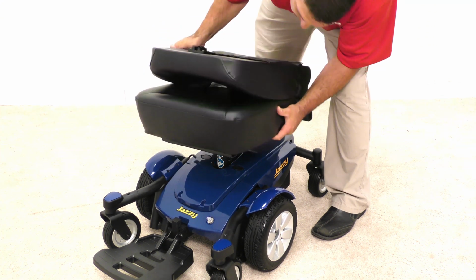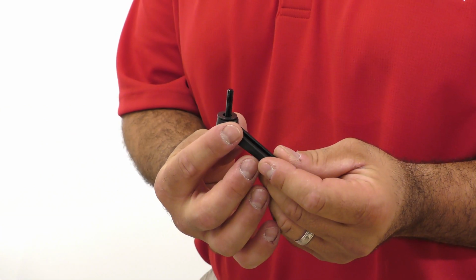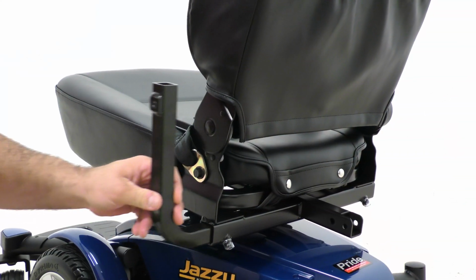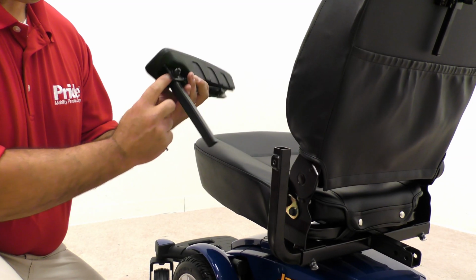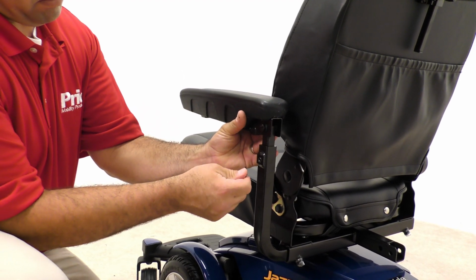Begin by placing the seat on the seat post, and then the headrest on the backrest. Tighten by the adjustment knob provided. Place the lower armrest in the receiver tube and tighten the set screw with the 4mm Allen wrench. Place the top of the armrest in the lower setting inside the armrest. Repeat on the other side.